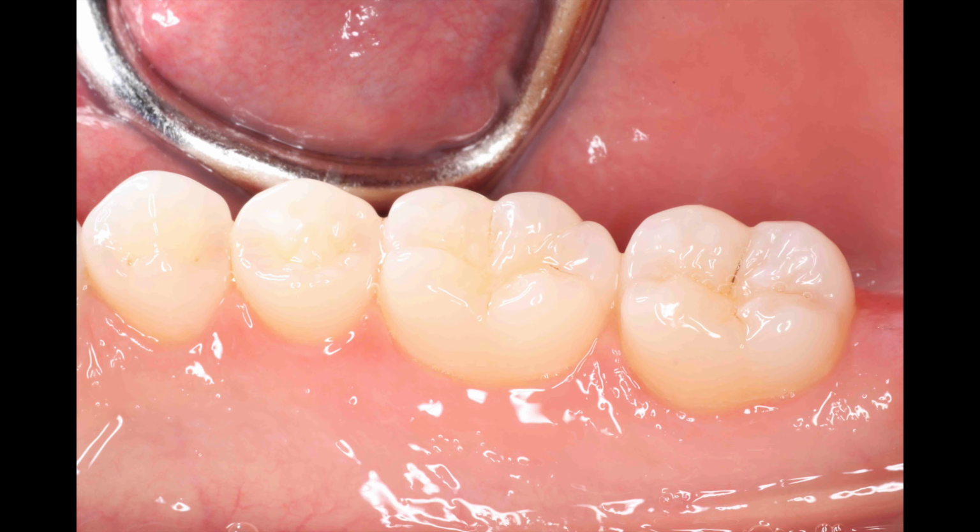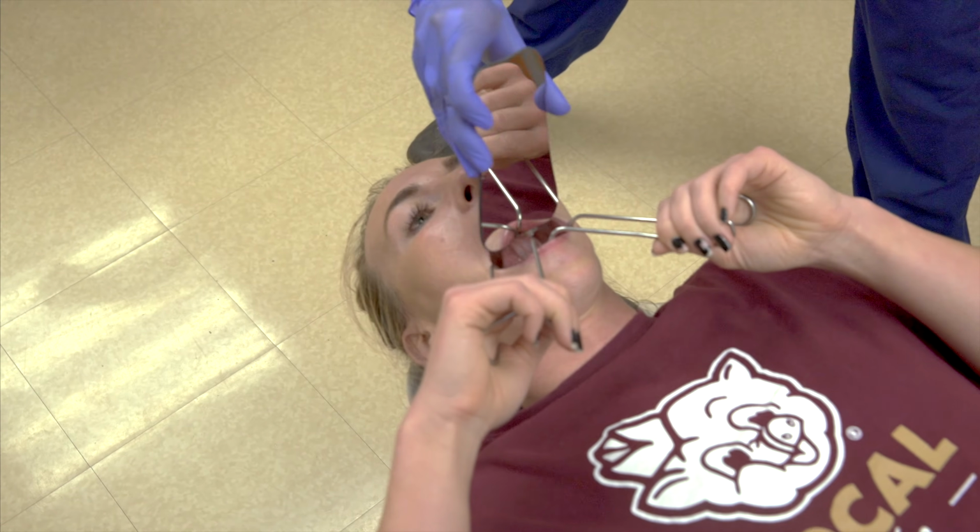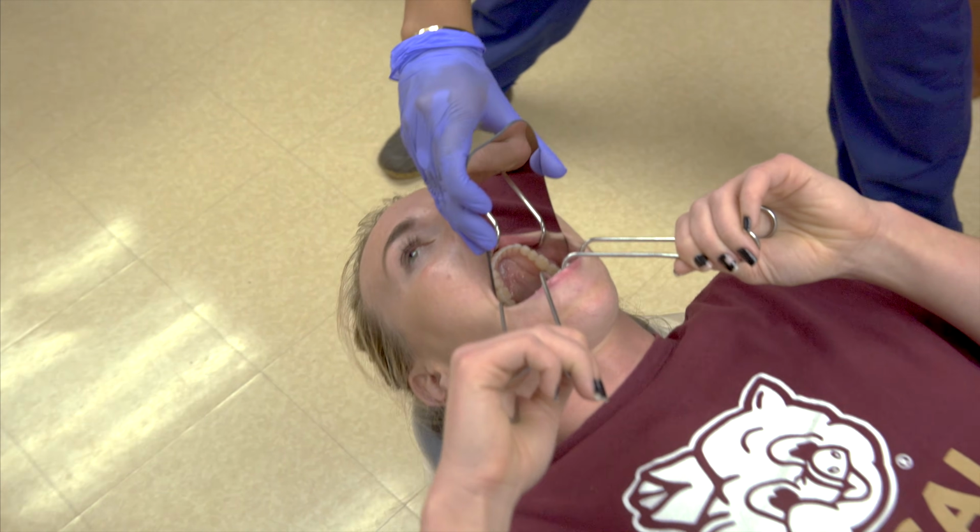We put this image in to show incorrect exposure of the image. This image is too bright. Lastly, we will take the occlusal shots, starting with the mandible.